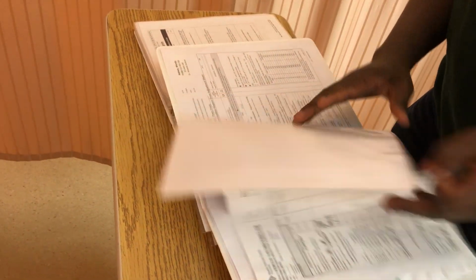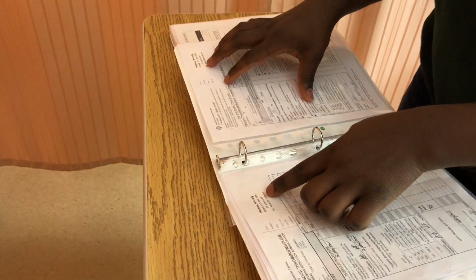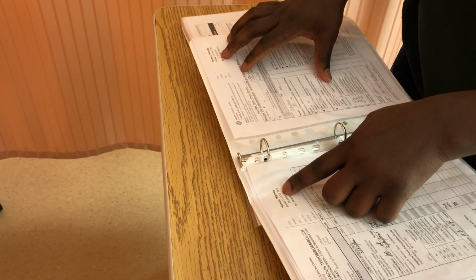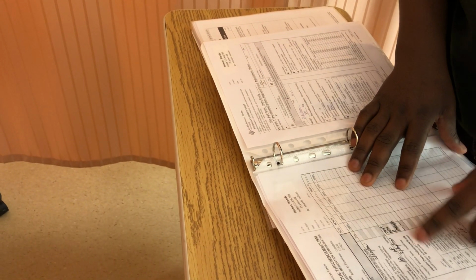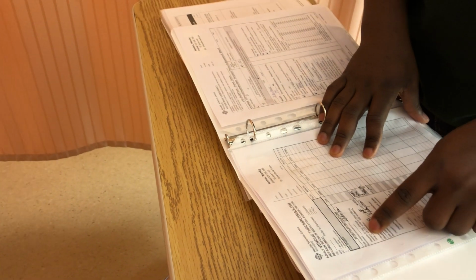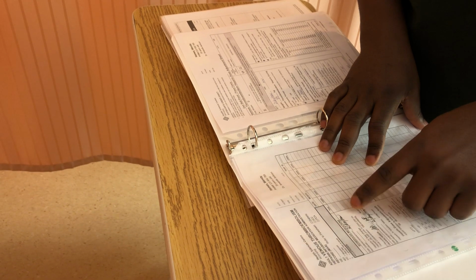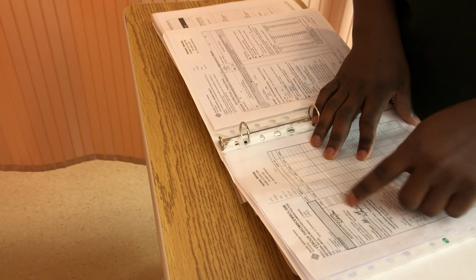The patient is Wendy, and the PIN number is 123456, and the order is for heparin IV bag change, and it's heparin 25,000 units in D5W 250 milliliters.